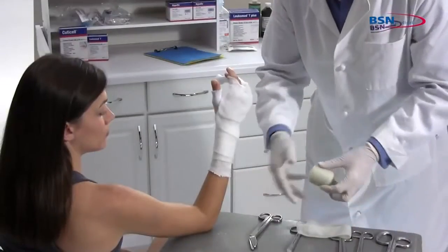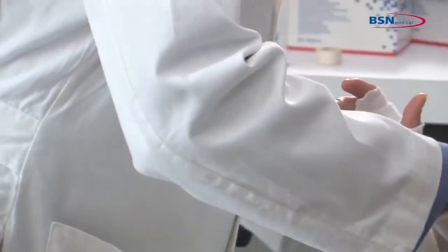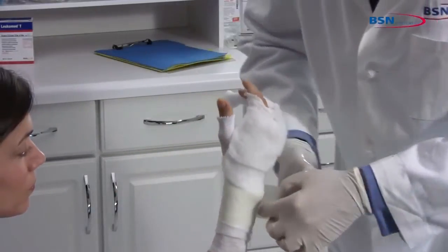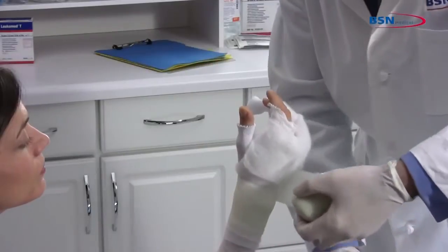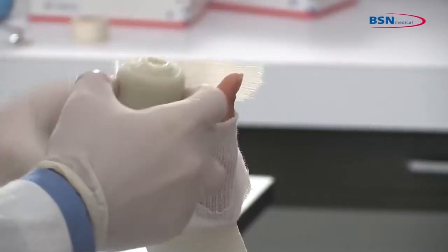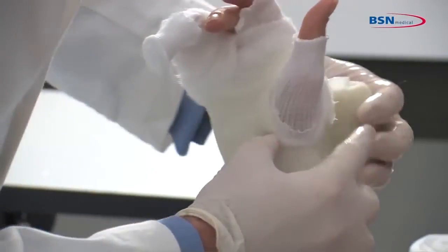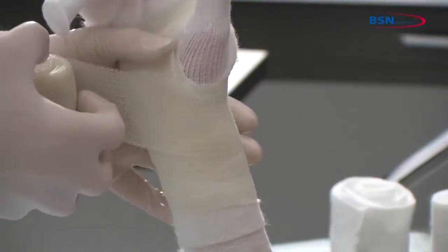Dip two-inch or three-inch cast tape in water, squeezing one to three times. Remove from water and squeeze one time to remove excess water. Start wrapping the cast tape below the wrist, working distally to the hand. Make a cut at the thumb to easily pass through the webspace. Curl the cut edges of the cast tape under to create a smoother edge, then work proximally to the wrist.